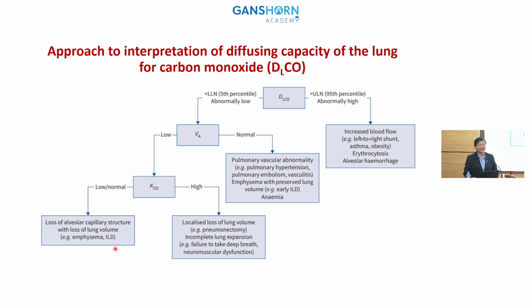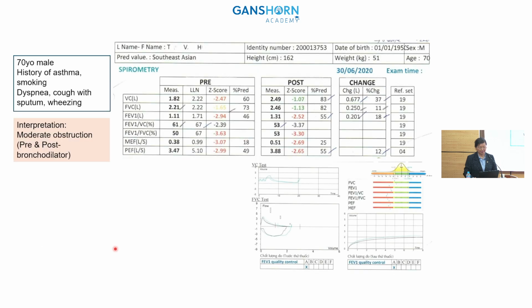So you can see that the role of plethysmography is very important, not only in the confirmation of the restriction, but also for the DLCO, a very important criterion.